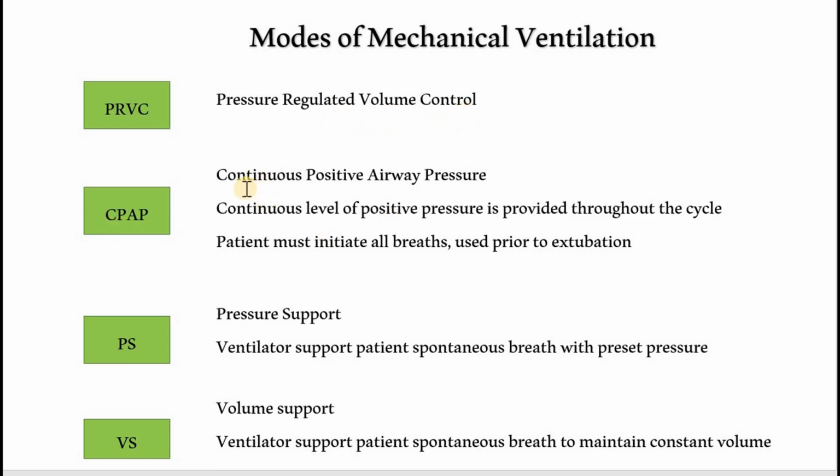Next is CPAP, that is continuous positive airway pressure. In CPAP, a positive pressure is provided throughout the cycle. That means during inspiration and during exhalation, a positive pressure is maintained throughout the cycle. So when a patient is on CPAP, you should not sedate the patient because the patient should initiate all breaths. There will be no preset tidal volume, no preset respiratory rate or no preset pressure. The patient should initiate all breaths, and this is usually used prior to extubating the patient.